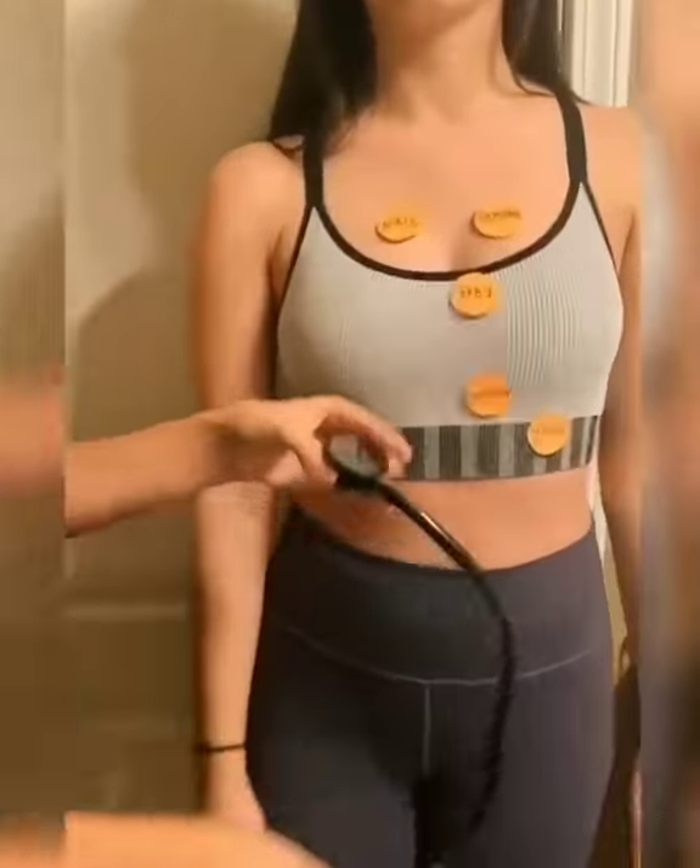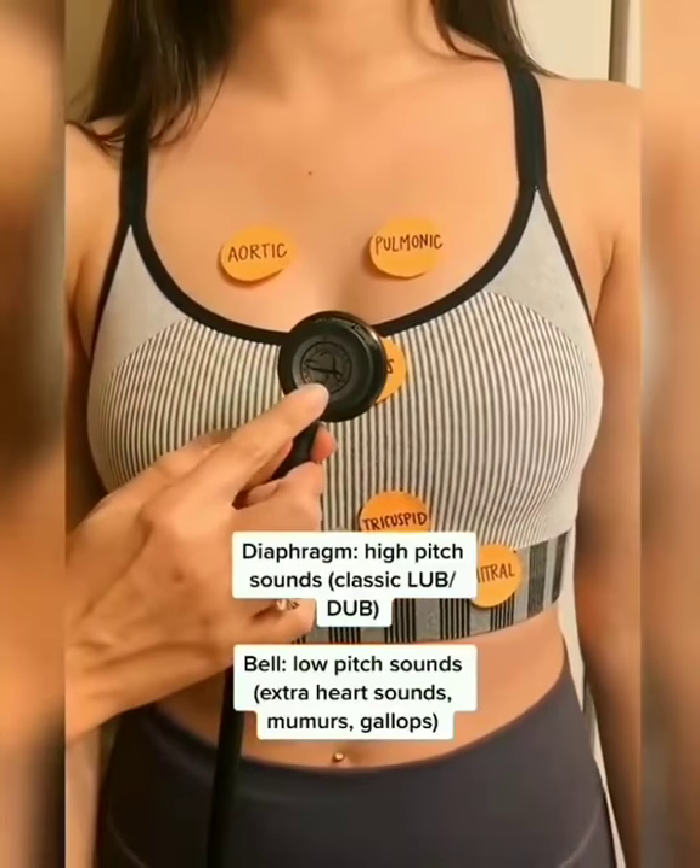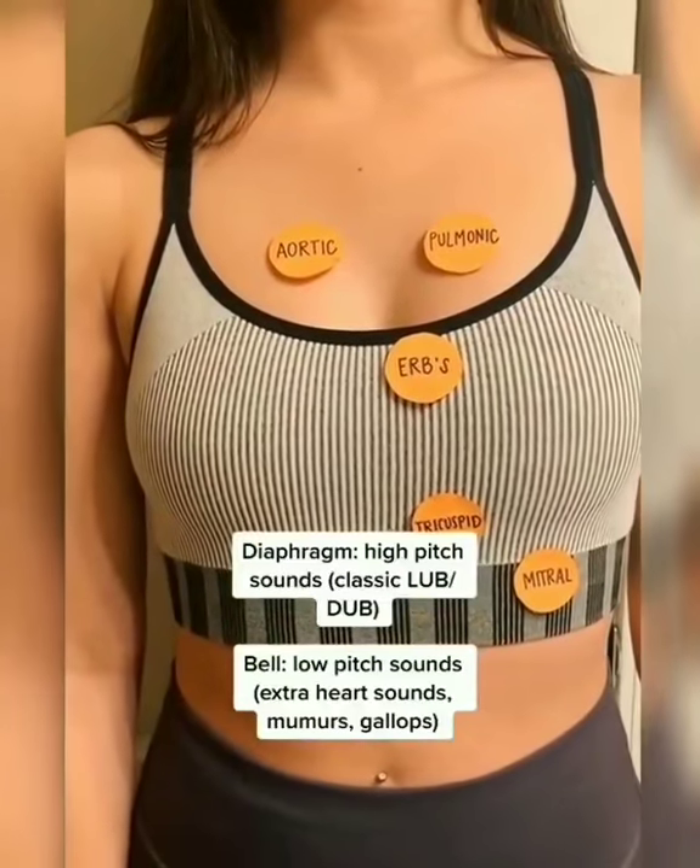Heart sounds and charting. Using the diaphragm, we're auscultating the heart for high-pitched sounds. We then repeat the same areas with the bell to detect low-pitched sounds. Reference my heart sound video to learn more on this.